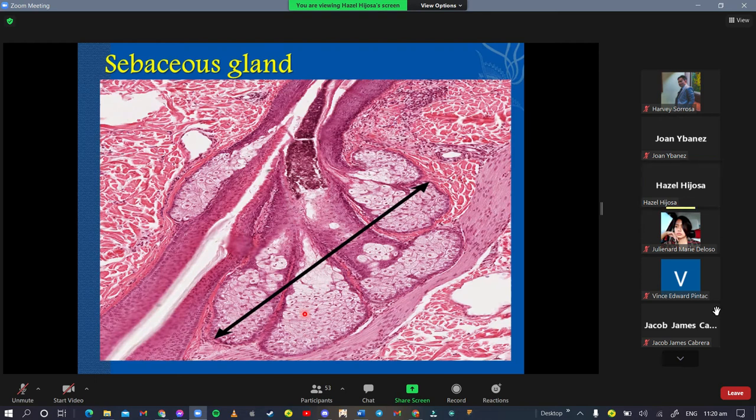Okay. And then based on gland cell participation in secretion, how do you classify this gland? Holocrine secretion. Why holocrine? Is it not merocrine, Doc? Merocrine would secrete via exocytosis only and doesn't really bring out part of the cell or cell membrane.